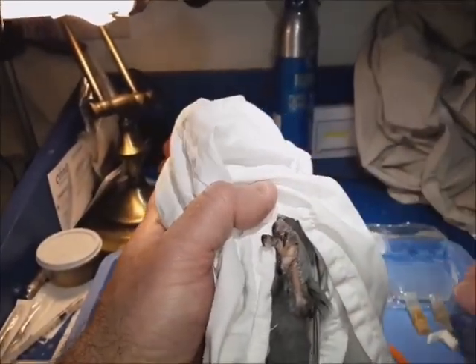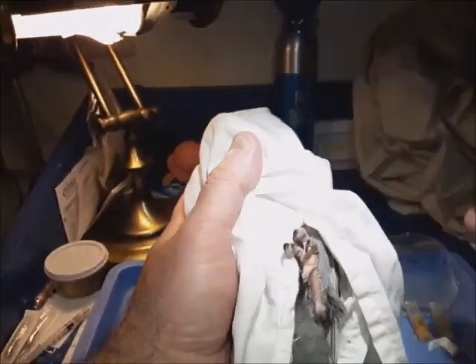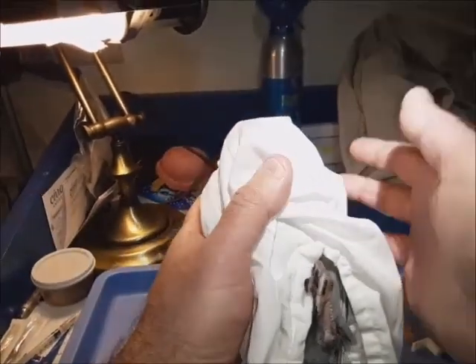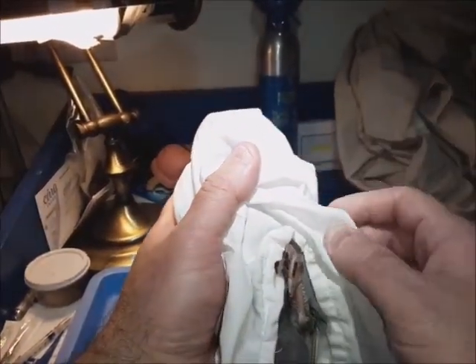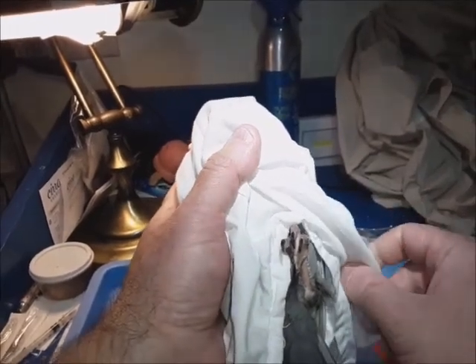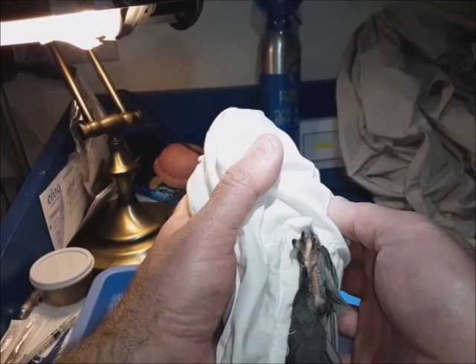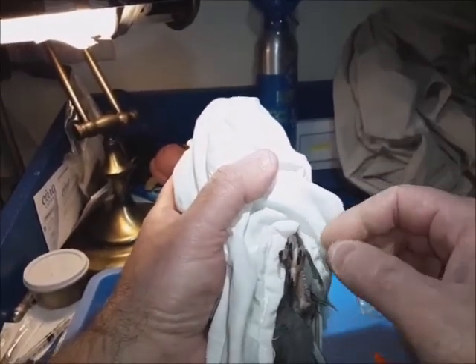This is how I give injections to pigeons or any other bird. If they struggle very much, cover their head with a small bag or cloth — a washcloth or a t-shirt — because they're more calm if their eyes are covered.